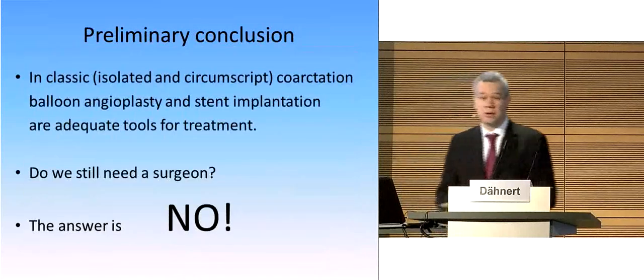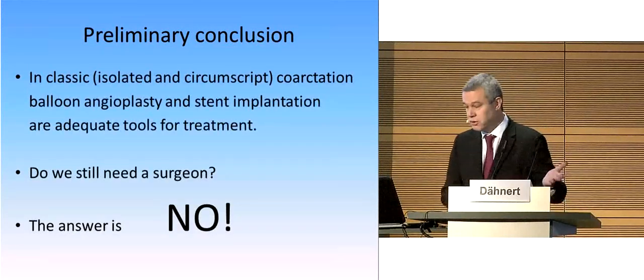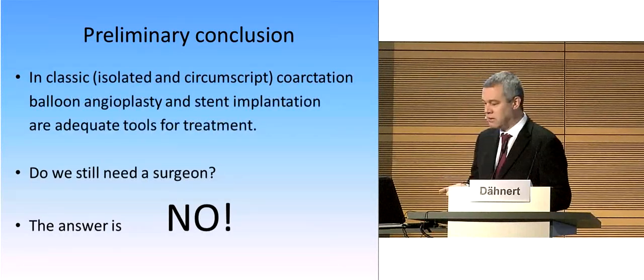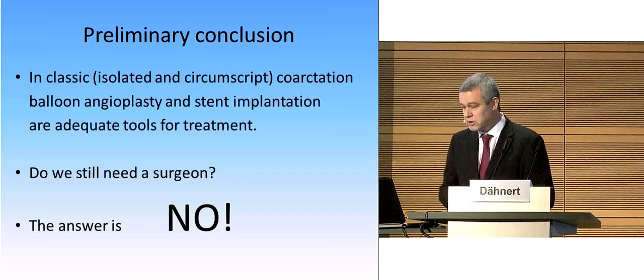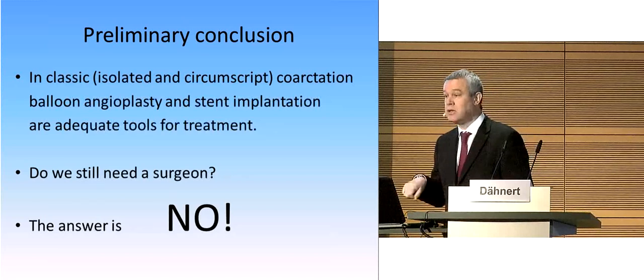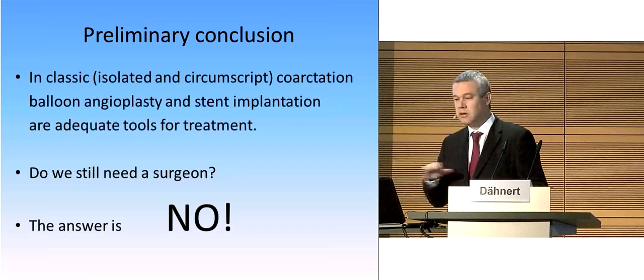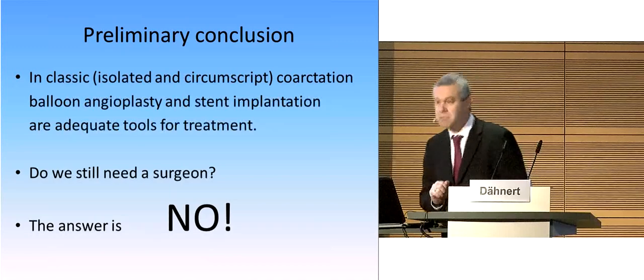So my preliminary conclusion, before we hear the surgeon, is in classic coarctation, balloon angioplasty and stent implantation are adequate tools for treatment. Do we still need a surgeon? Not for that. No. The surgeon can treat other patients in this time. Thank you.